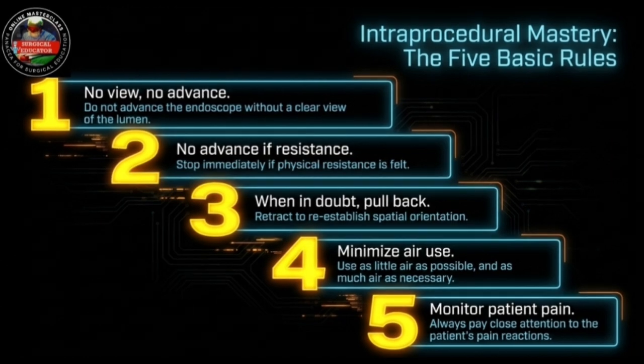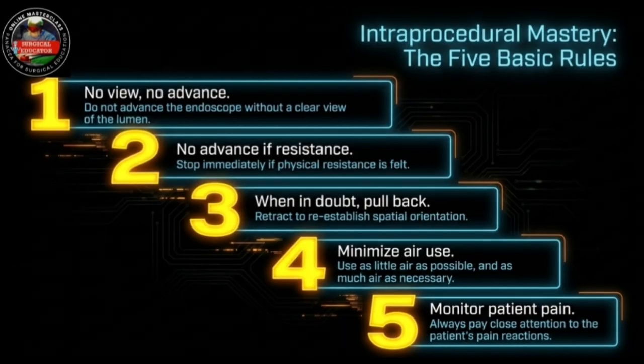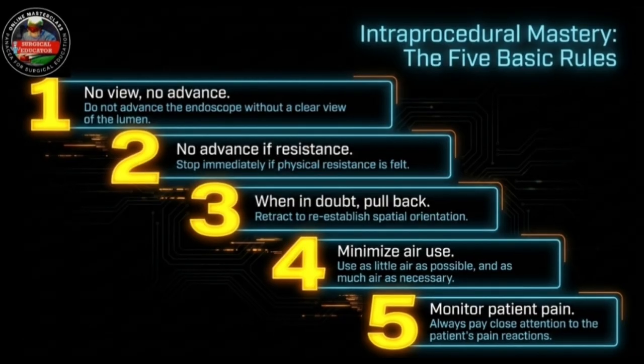That makes perfect sense. So as you are carefully insufflating and navigating, you need to know exactly where you are in this elongated tube. Exactly. Which brings us to slide 7, covering endoscopic topography.